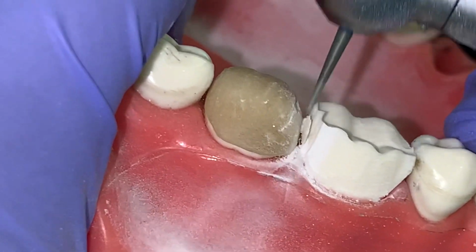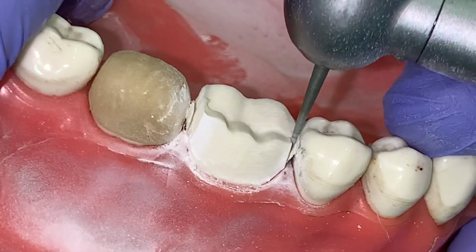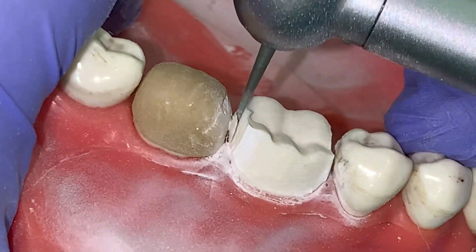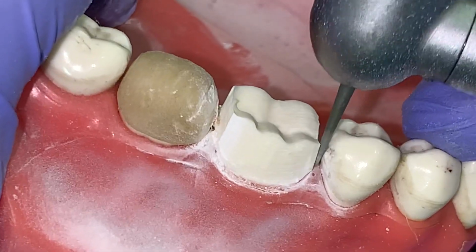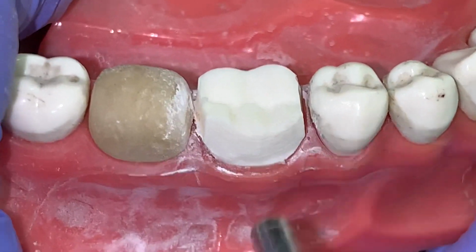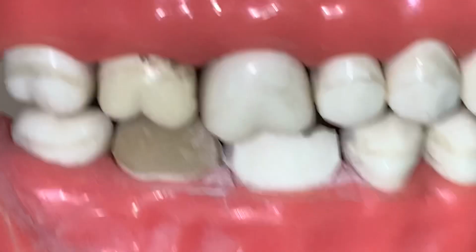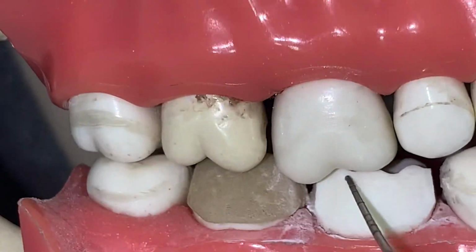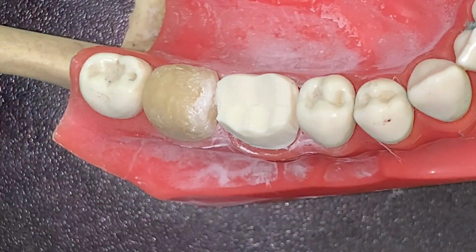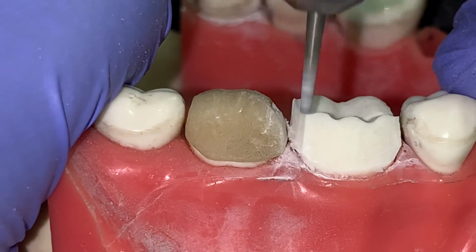So I'll leave a very thin shelf of tooth so that I'm very careful that I'm not touching the adjacent tooth. Now this shelf can be removed with a hand instrument also, or with the burr itself. It is always better to under prepare and watch closely and then complete your preparation, than over preparing a tooth in one go and then regretting that we have lost the precious tooth structure. So it is always a better idea to go slow.